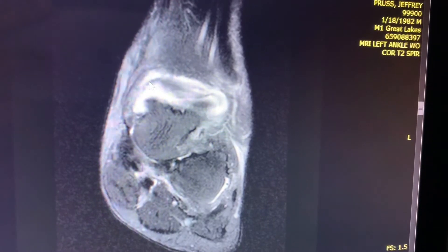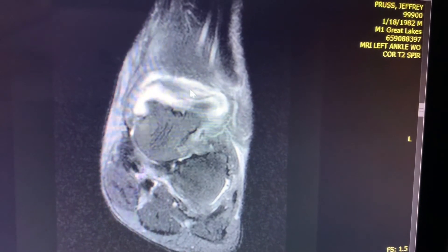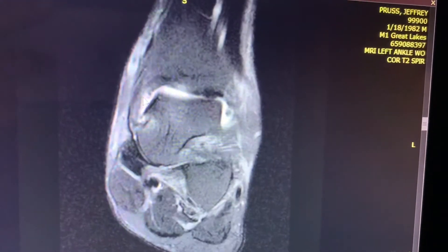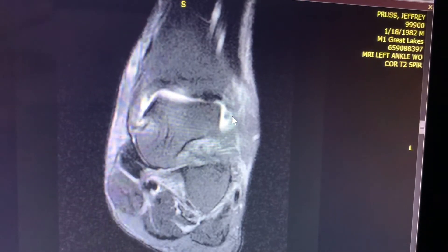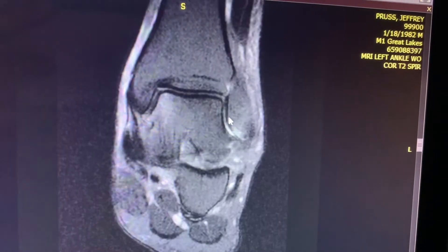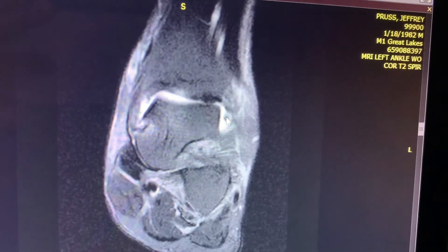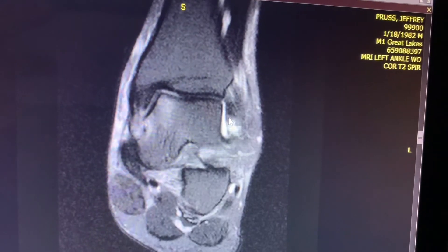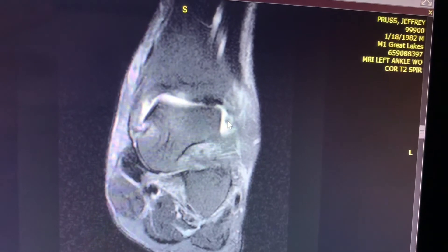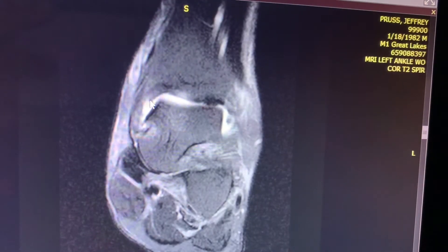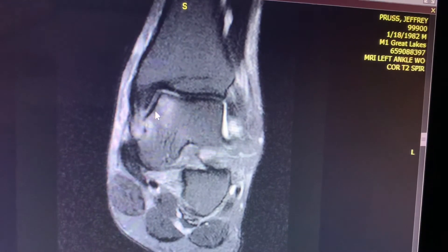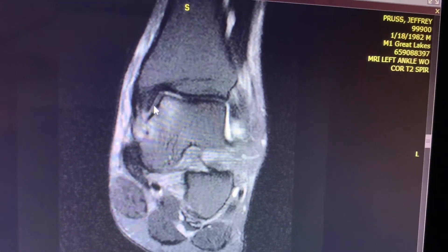On the coronal images, this is that structure going all the way across the ankle joint, inserting onto the medial malleolus here and arising from the lateral malleolus here. There is edema involving the talar dome.